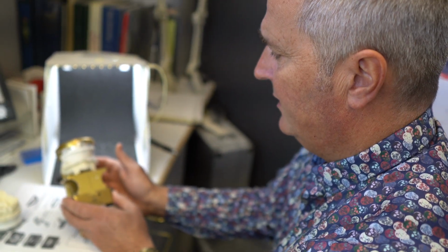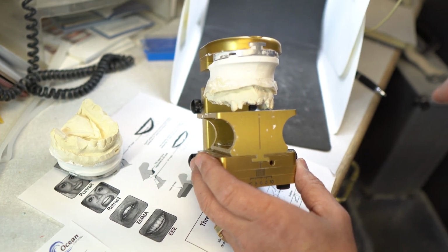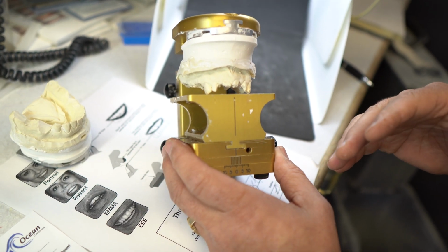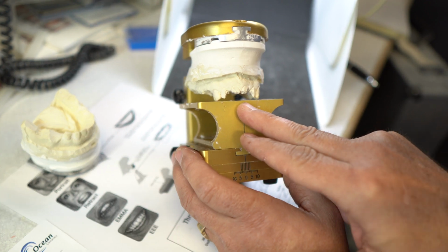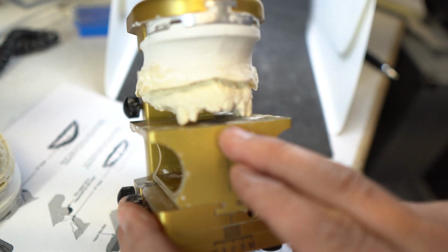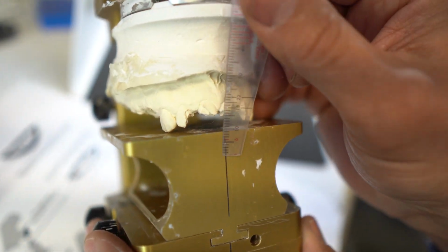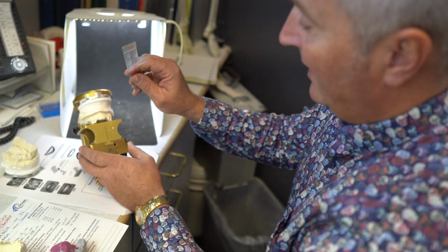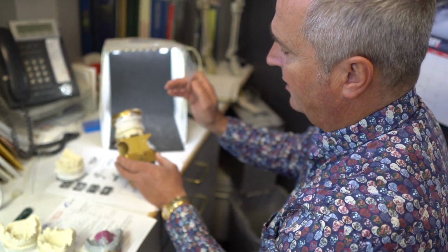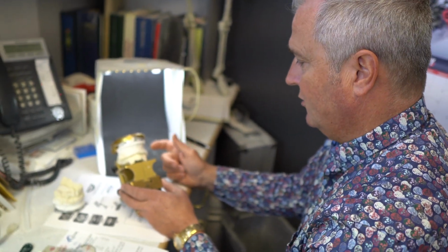And Dr. Carlson, back in the day when Dr. James Carlson explained to us, the key to success with occlusion, you number one got to have a level plane of occlusion, and number two, to establish where that level plane actually is, you want to find out where the F point is, which is the incisal edge position of the centrals and or midline. So if you look right here, it lines right up with this little indicator, and ultimately that's what we're looking to figure out. And then we build a level plane of occlusion back from there with a compensating curve. Very, very important, just like everyone's been taught in dental school.